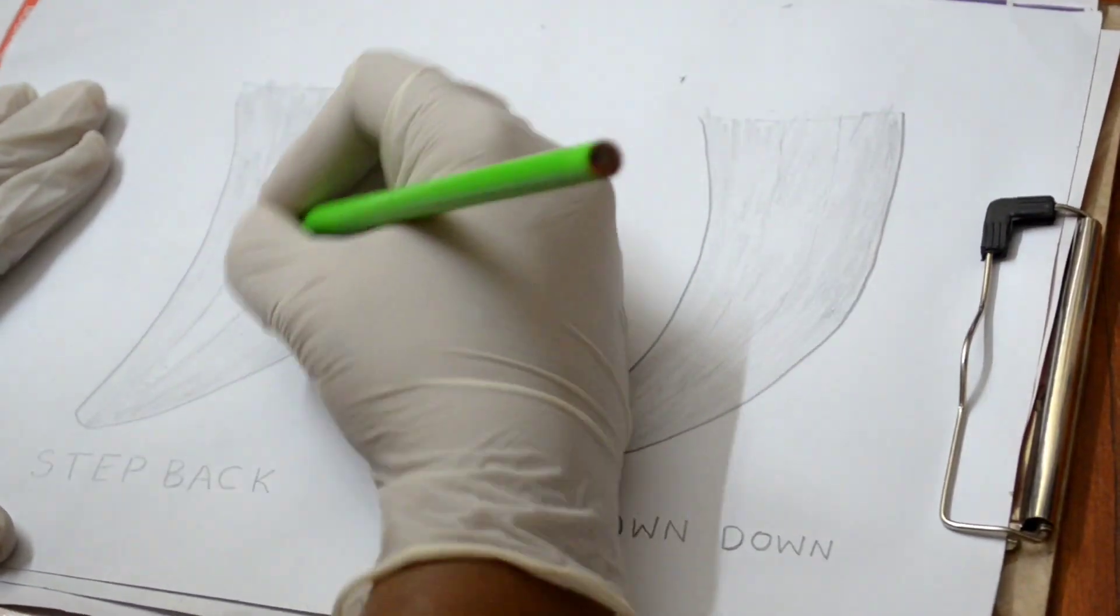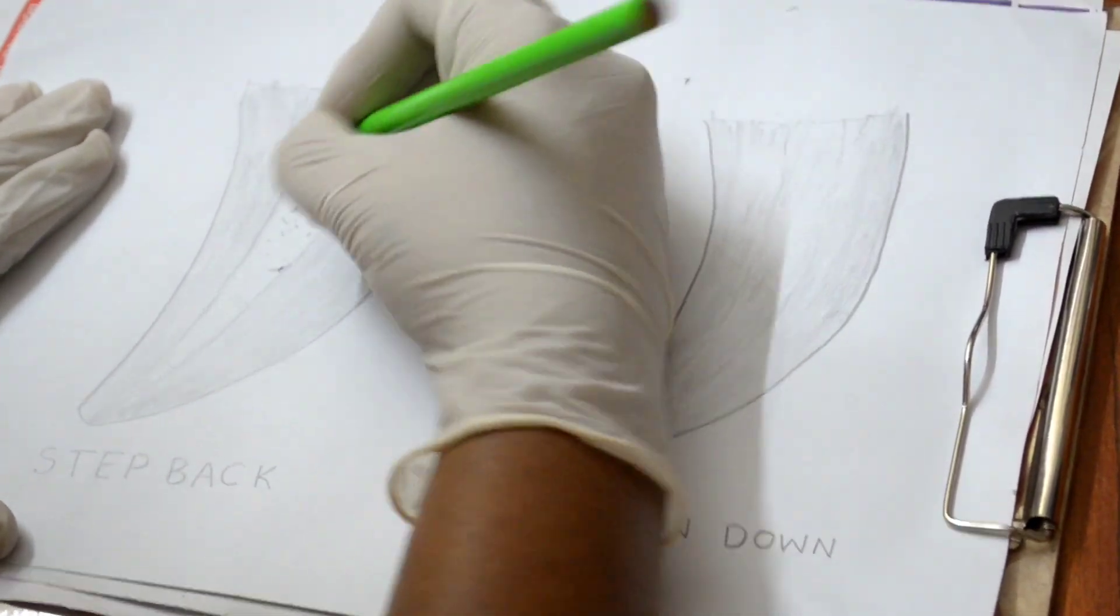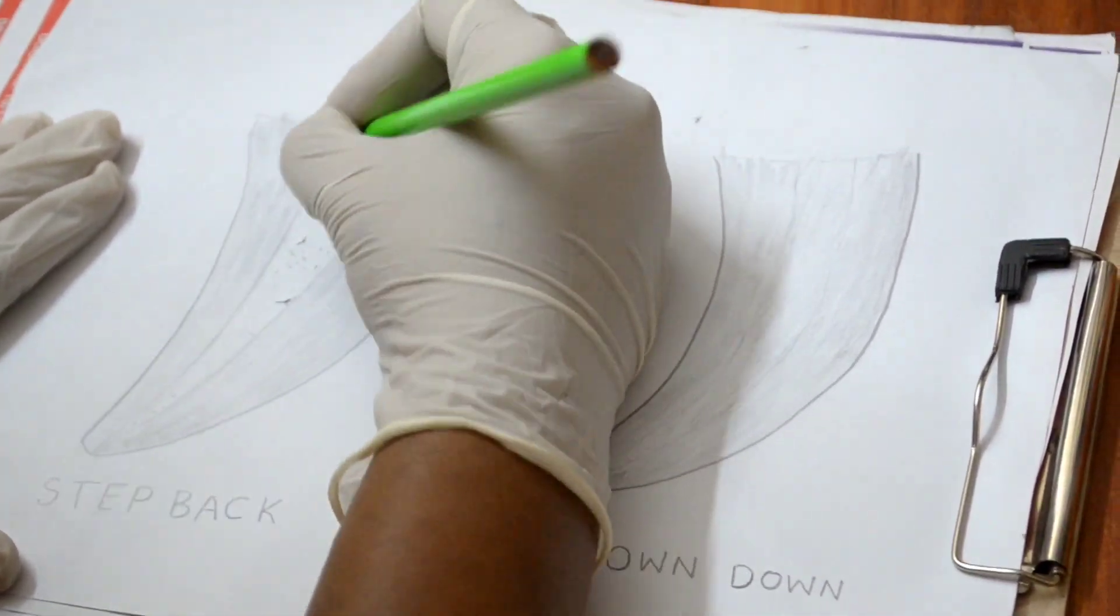Step back technique involves preparation of the root canal first in the apical one-third, followed by the shaping of middle third and coronal third.